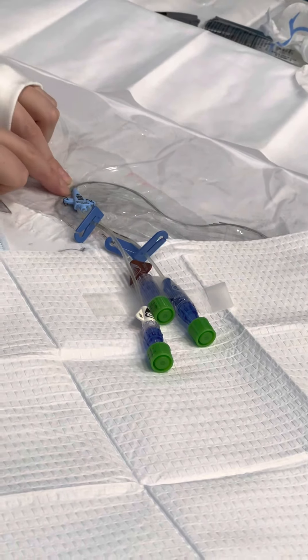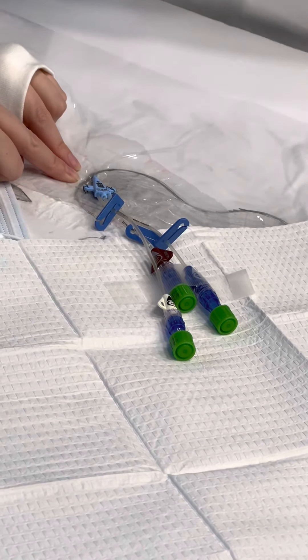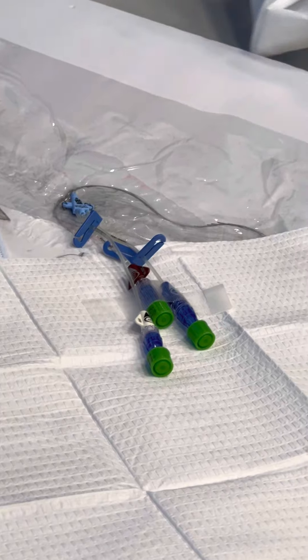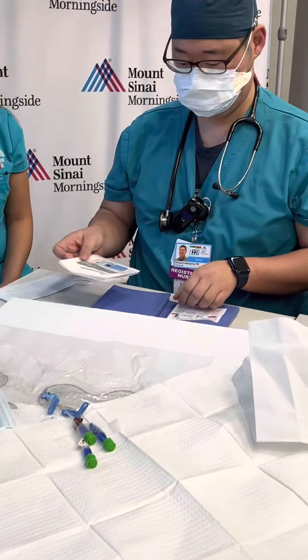This is where you'll assess the insertion site. We want to check for redness, pus, anything that's concerning — escalate that to the doctor. Now, sterile technique. Now we switch to sterile.